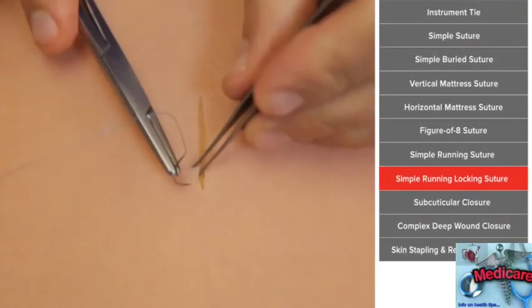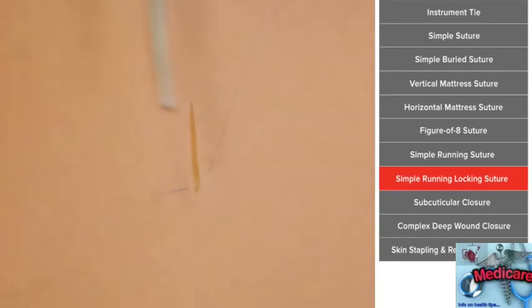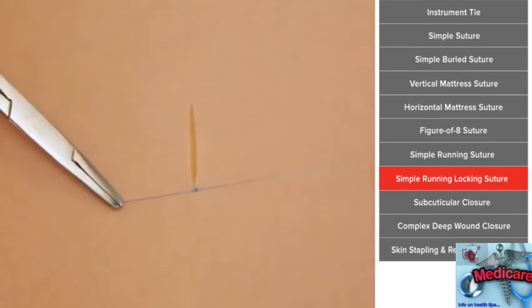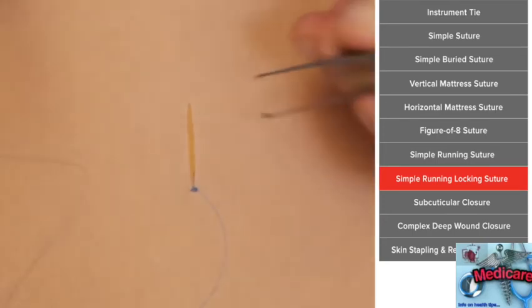One variant of this is what's called the simple running locking suture. Sometimes you are closing a wound quickly, an example would be a big scalp wound where it's bleeding and you just need to get it closed. And it's hard because it's gaping open a little bit. As you start to tie your suture, it's not staying in place. Sometimes you can have an assistant hold that for you, but when you're by yourself especially, you can lock the stitch each time.